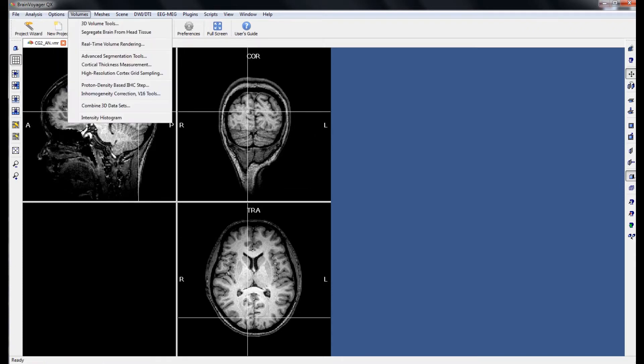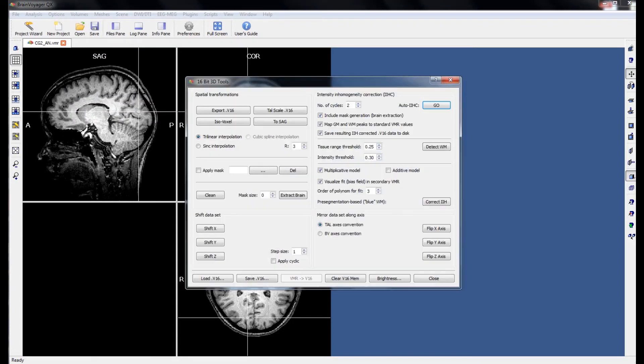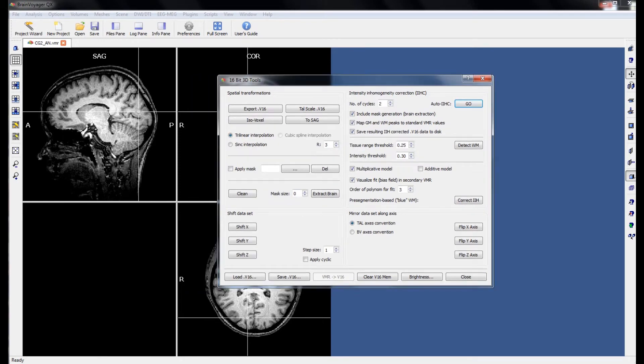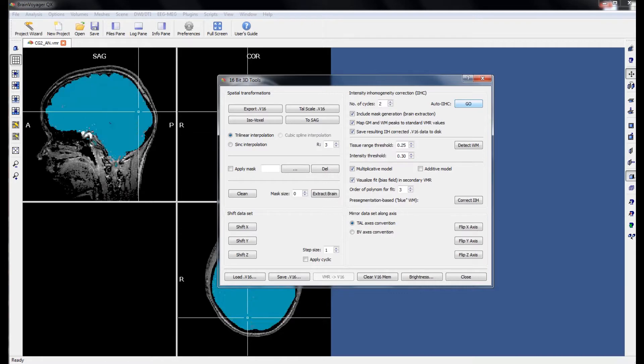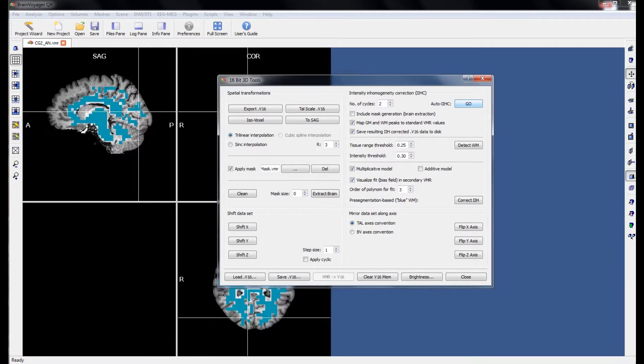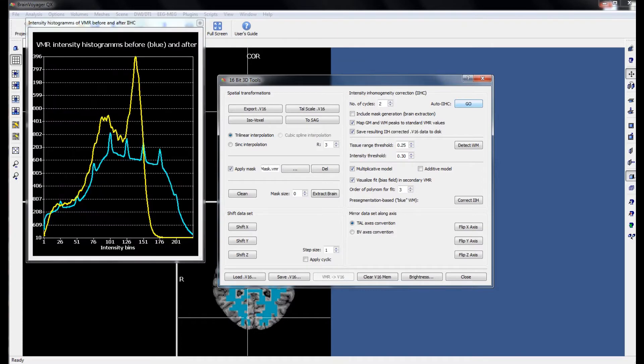To do this then, we go to Volumes and Inhomogeneity Correction. What we are looking for is the Auto IIHC Go button in the top right hand corner. This algorithm will do two things for us. The first thing it will do will be to strip the skull from the brain. The second thing it will do is to correct for those inhomogeneities in the grey and white matter.